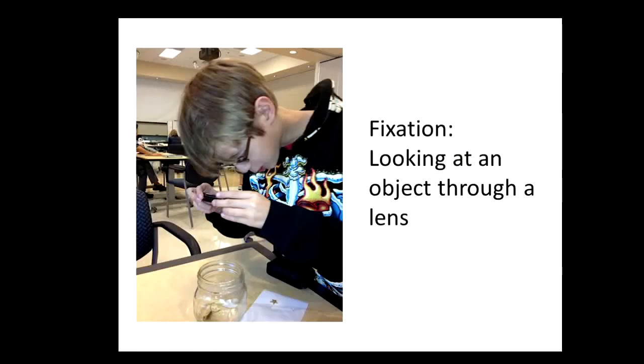Fixation is simply looking at an object through a lens. Here a boy is looking at a scorpion. Looking at bugs is always fun, I think.